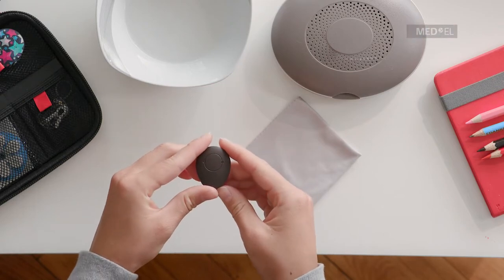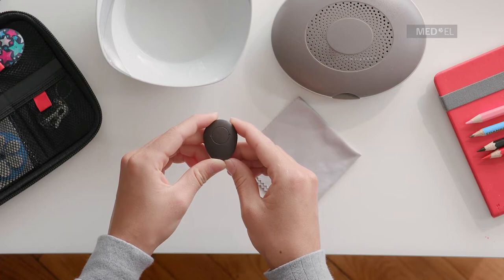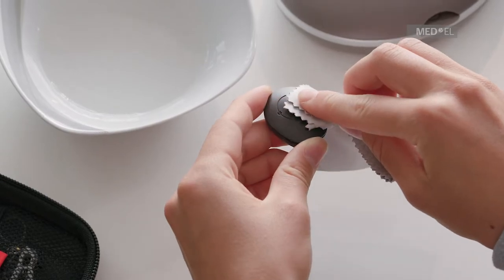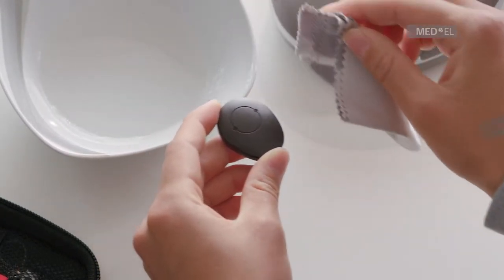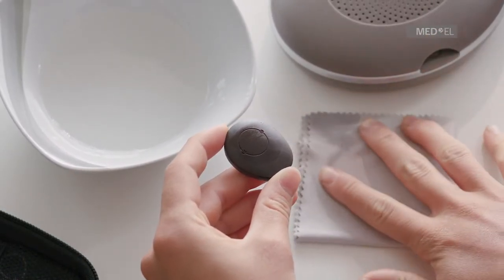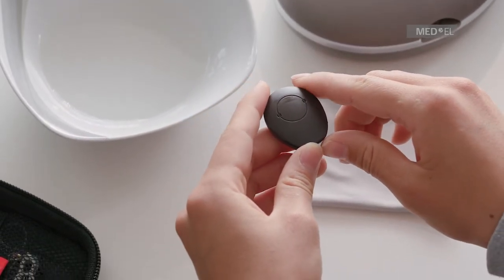Medel recommends cleaning Samba 2 weekly for hygienic reasons. Only clean the outside of the device. Do not clean Samba 2 in or under water. Use a damp cloth to gently clean your audio processor. If necessary, use non-abrasive household soap together with a damp cloth. Prevent water from running into Samba 2 via the microphone openings or the battery compartment.